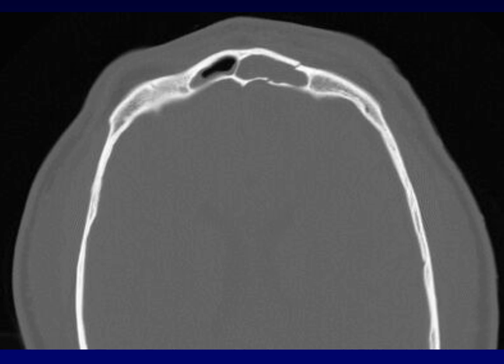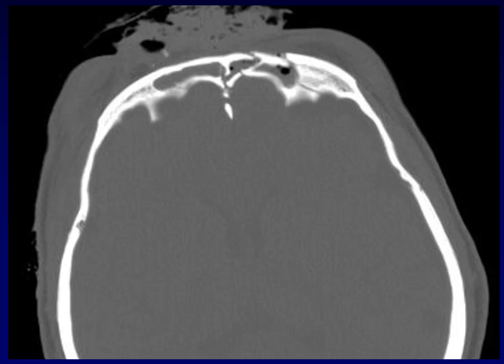Here's an example of a non-displaced fracture extending through the left frontal sinus. You can see that both the anterior table and the posterior table are involved, with blood filling the sinus, but there's only minimal displacement of the fragments. Here is a more complex fracture where there are displaced fragments of both the anterior and posterior table of the frontal sinus.